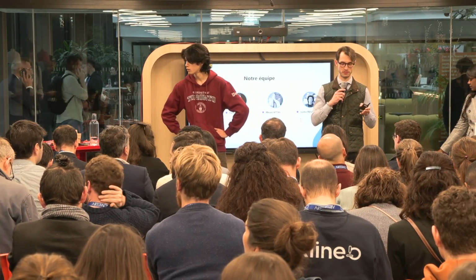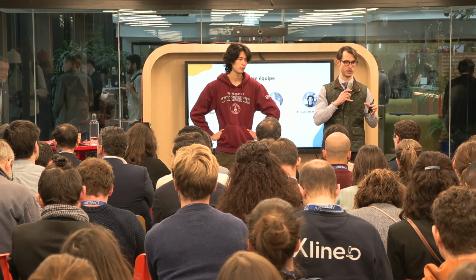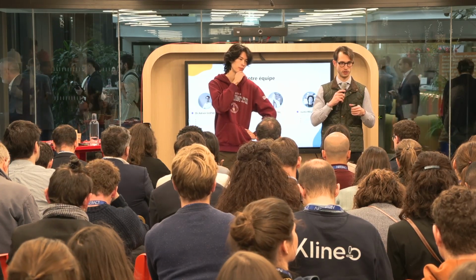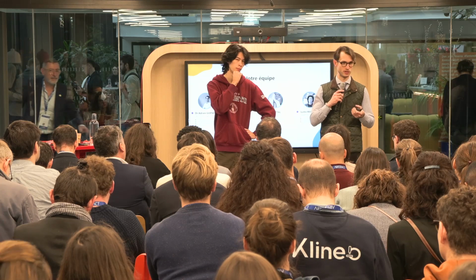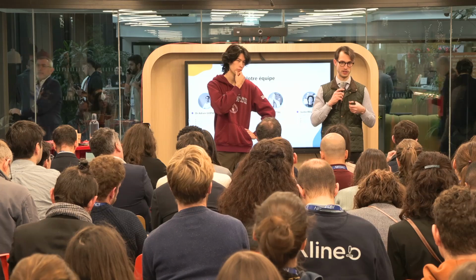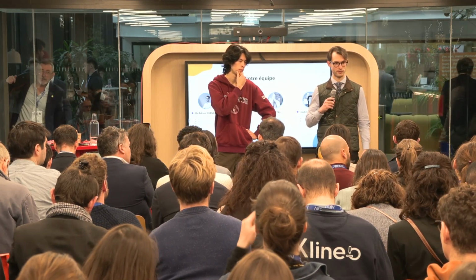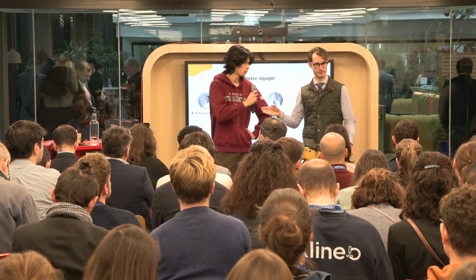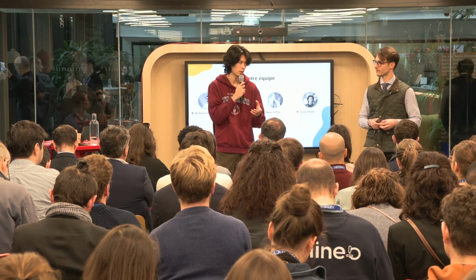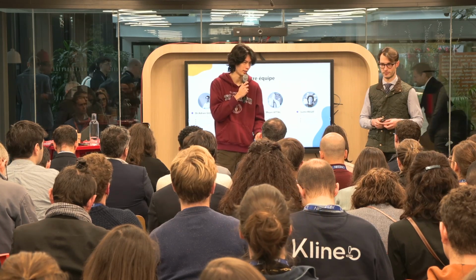And in case, of course, of false positive, the idea is that these tools are always used by a human radiologist. So you always have both views. And the radiologist is there to look at the images, and if he thinks the AI is suggesting something that is not true, then he has the last word. The AI does not. So he can flag false results and improve the model? Yeah. This is a specific choice that we made, that all AI tools will be only practitioner-facing. So the patient is never actually going to see the AI do anything.